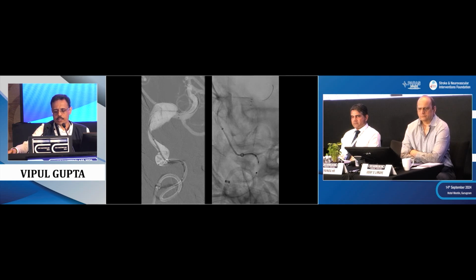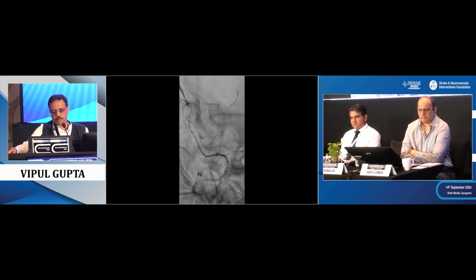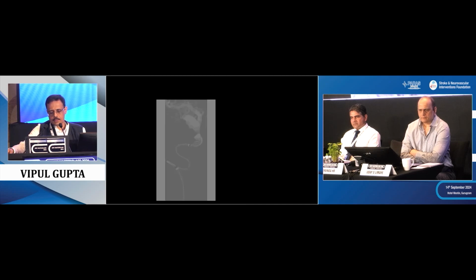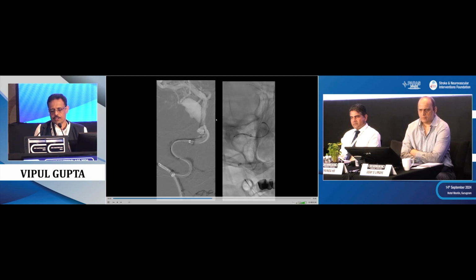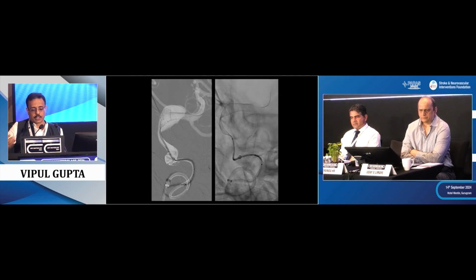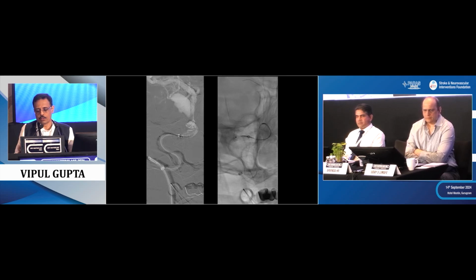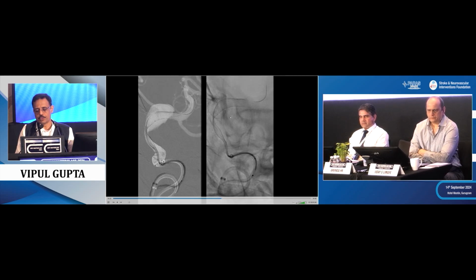We tried many times. I tried push, pull, we resheathed, re-delivered, again resheathed, again re-delivered, different forces. And while it looks straightforward, in this region, if you see, the flow diverter kind of twists. Now looking back, maybe we should have taken distal access more distal, but the proximal access was so bad, we were not able to manage. And after a lot of struggle, it was just opening up to this degree here.